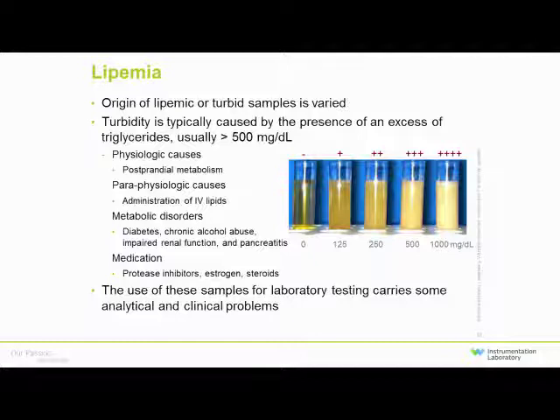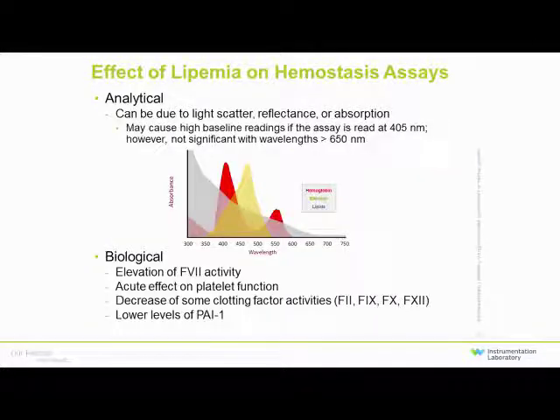So the use of these samples for the lab carry some analytical and clinical problems, but they're probably the least frequent sample type with the pre-analytical problem that we see. But the effects that we see for hemostasis specifically are analytical and biologic.